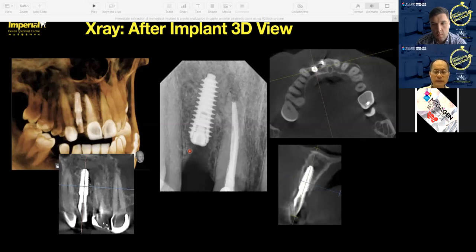So therefore, to answer your question, Rolando, how is it that we can achieve a high torque? It actually comes from the knife edge, which cuts deep into the bone marrow system. All right, I hope I have answered your question. Yeah, you did. Yes. Thank you for that.